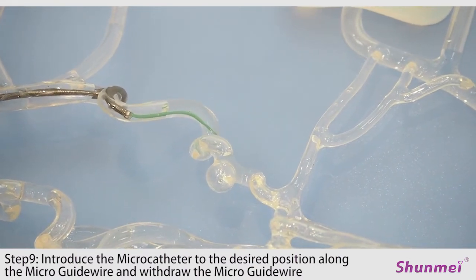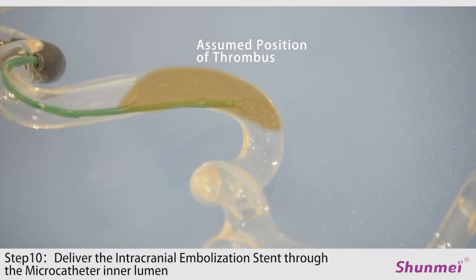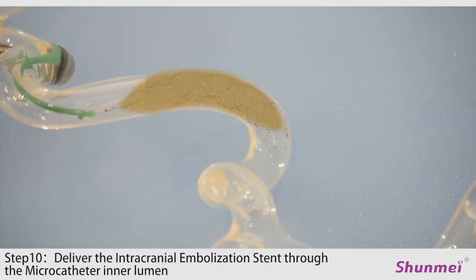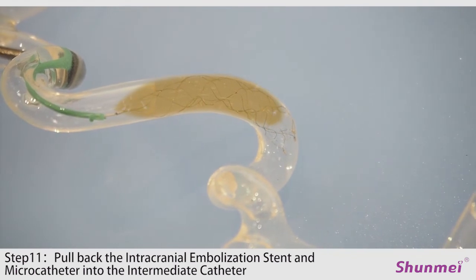Then, we withdraw the micro guide wire, and then deliver the intracranial embolization stent into place through the microcatheter inner lumen. Next, release the stent. The stent is fixed when released. Then, withdraw the microcatheter so that the stent will be deployed at the thrombus site. Wait a few minutes for the stent to catch the thrombus.